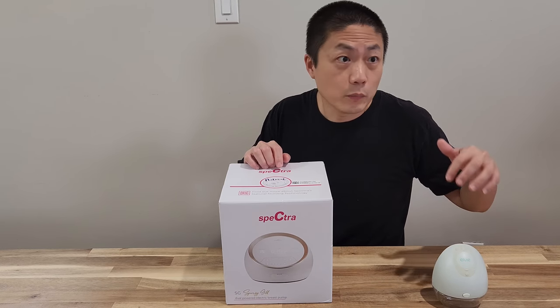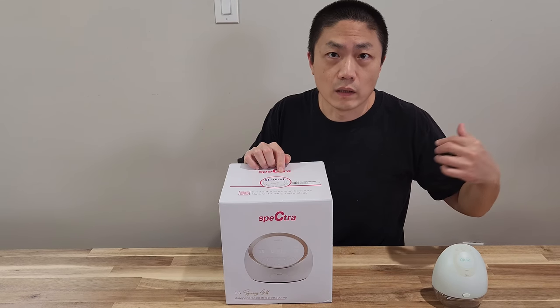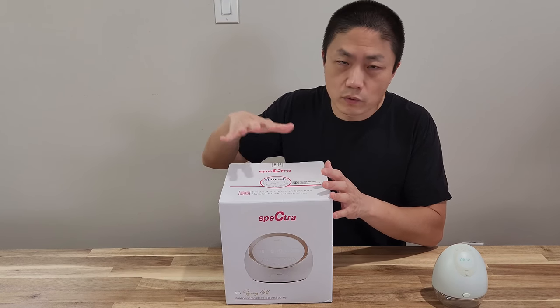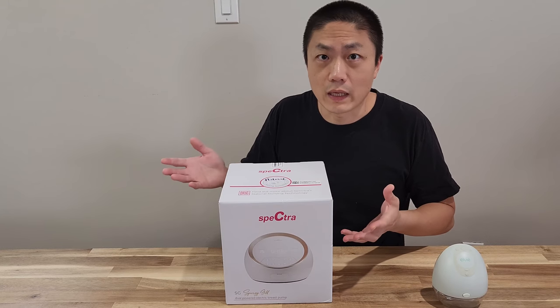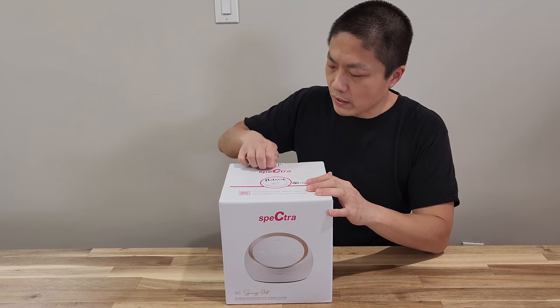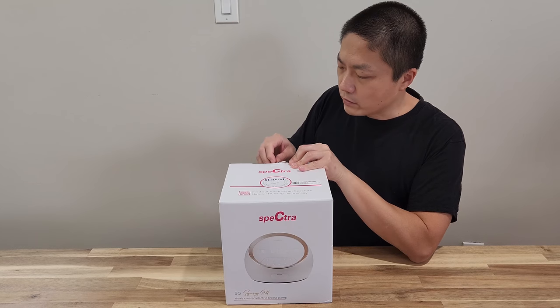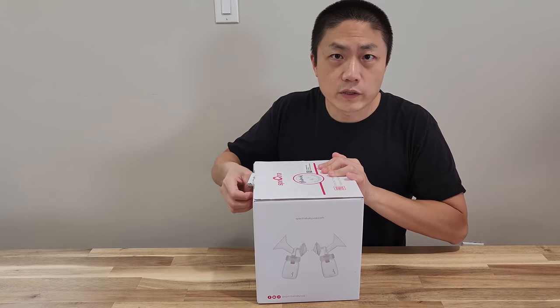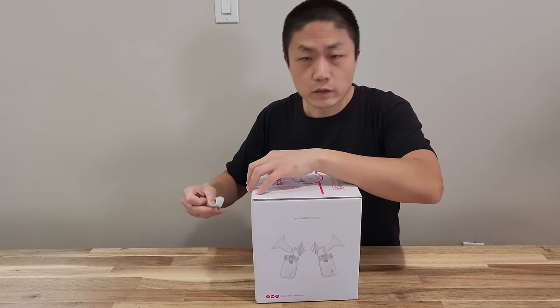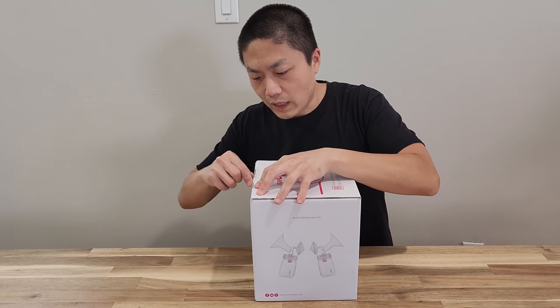For this time around with our second kid, we also got this one reimbursed up to $500 for the Petra. So just make sure you check with your insurance. Each one is a little bit different and they change the rules every now and then. With the LV for the first kid, we were able to get not only the LV for free, but also get the Medela rental at the same time.